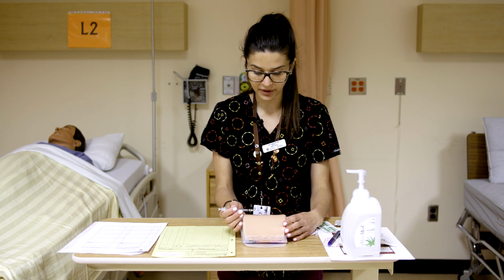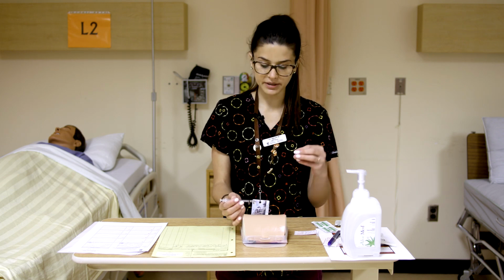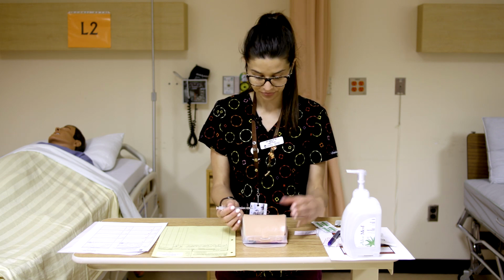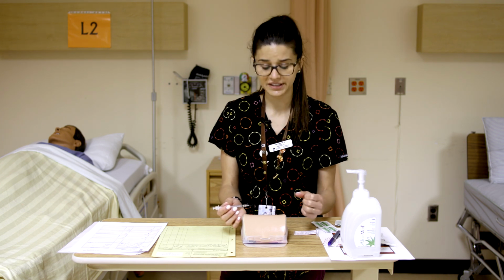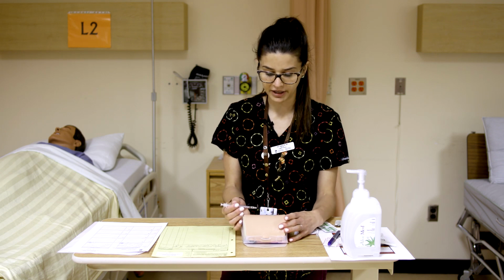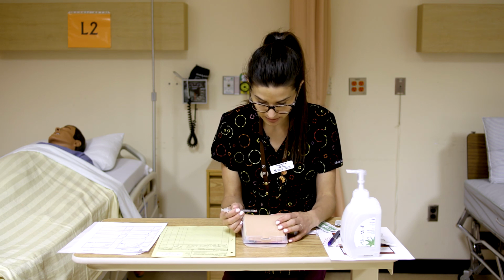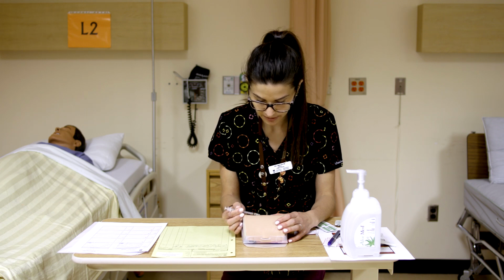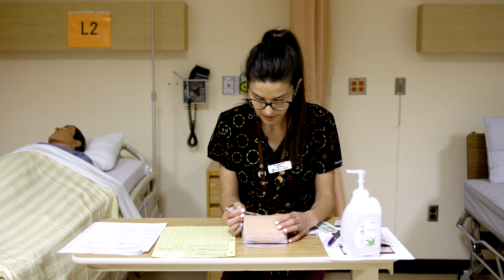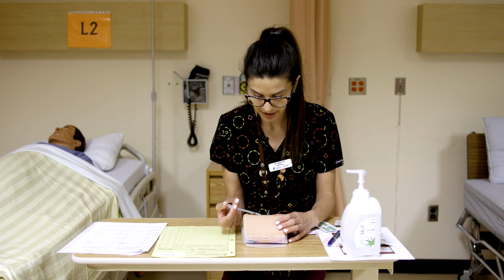So also with an intradermal, as mentioned, you're almost going parallel to the skin because you're just barely piercing that skin. You're not going deep in at a 90 or 45 degree angle. You're going to go at a 5 to 15 degree angle. So it's very, very narrowly tilted, this needle, with the bevel up. So we're going to go ahead and inject with bevel up at a 5 to 15 degree angle. You're going to go in a couple millimeters there. You could go all the way to the hub, but typically you just go about halfway, and then you're going to inject, and you see the bleb there.